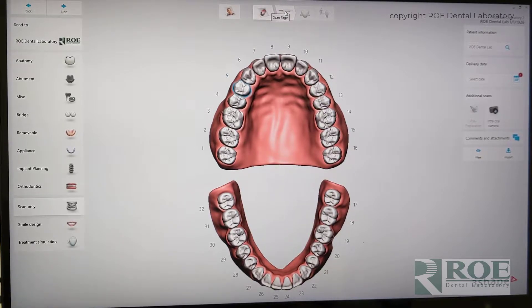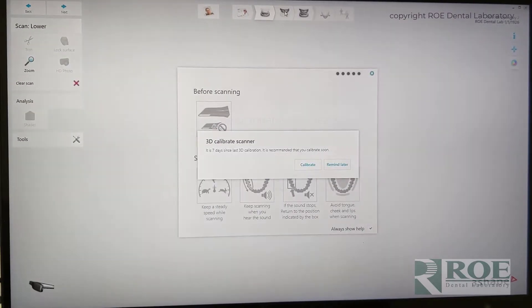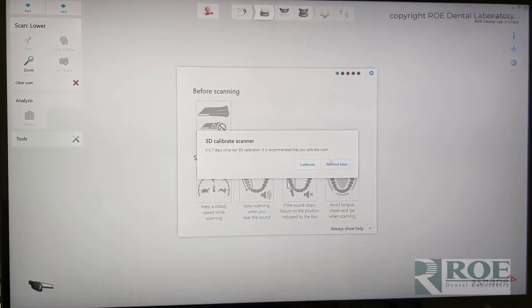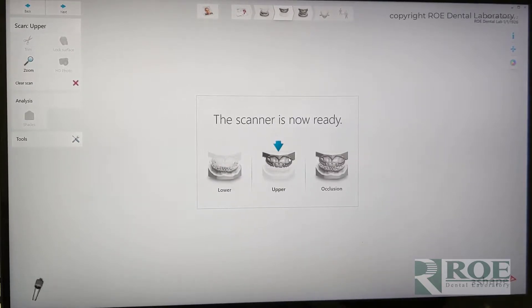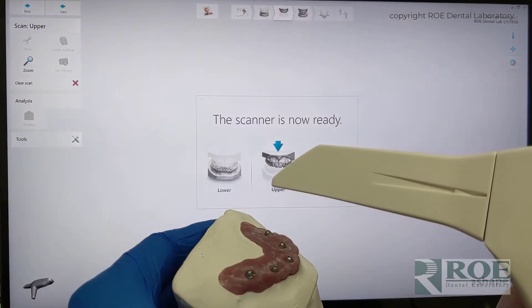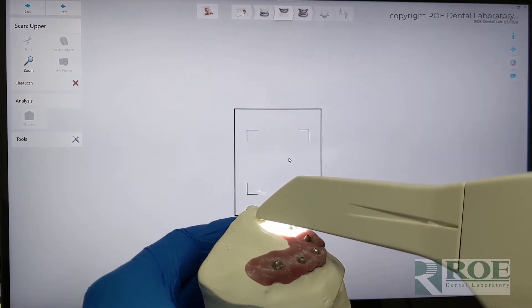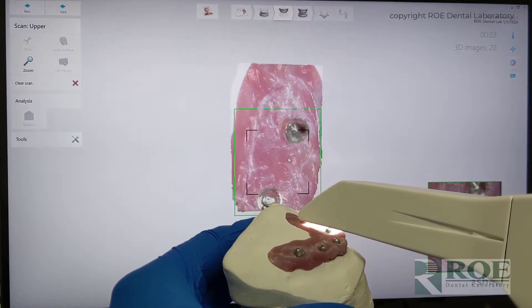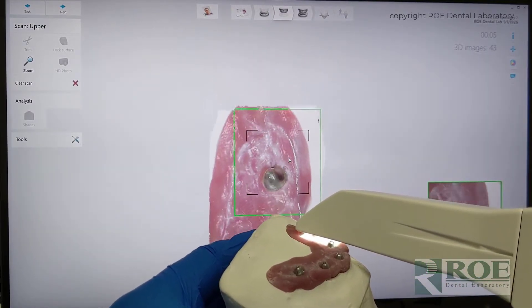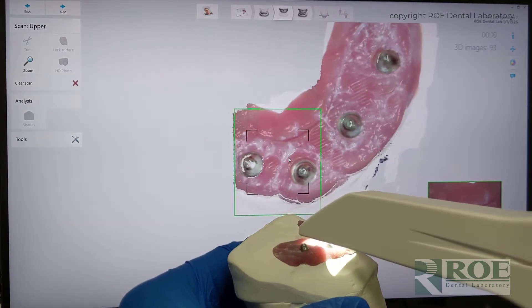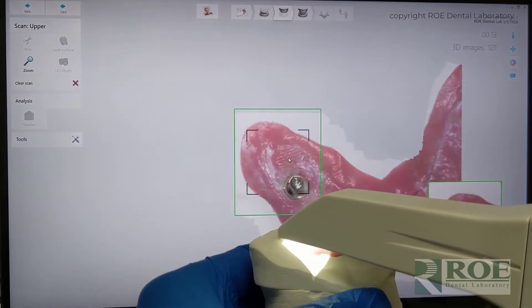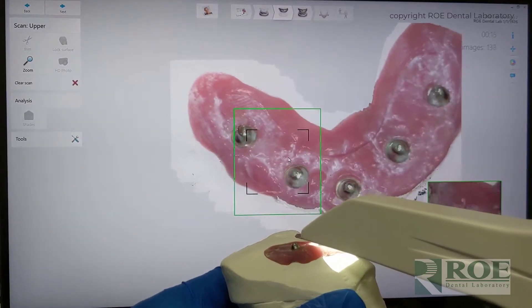I do have to pick a tooth for some reason. And then we're going to click scan. We've already calibrated. Pick the upper. And here we go — this is going to be a really quick, simple scan. All we want to do is capture the tissue around the MUAs, and that's all we need.